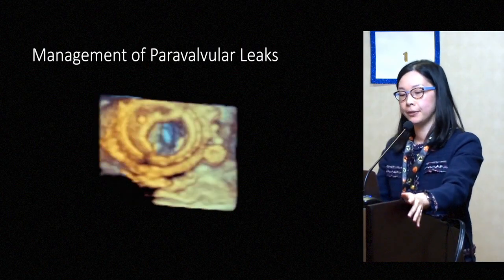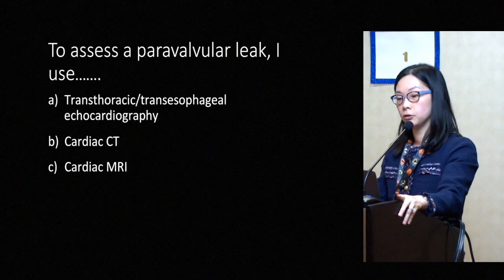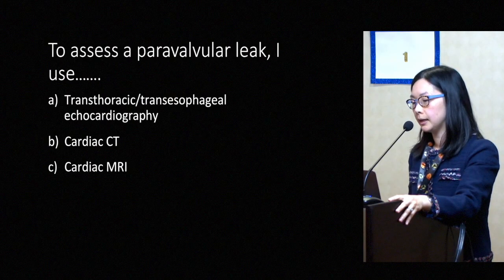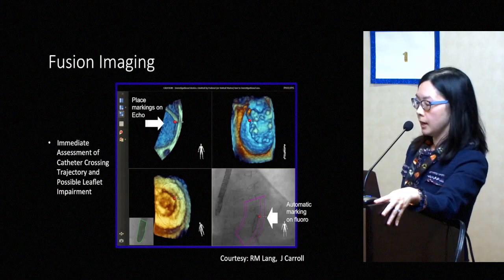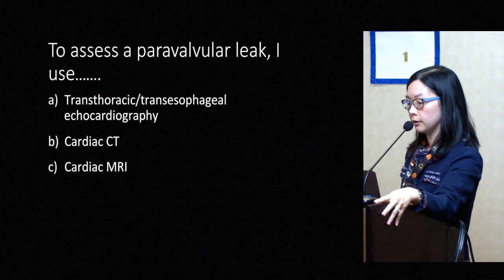But if you look at the statement that was released in 2017, just in the last month, about clinical trials for paravalvular leak, you'll see that echo is recommended, as it takes up almost half the table, and then fluoro has a little line here, and then cardiac CT and MRI are almost half the table. But really, if you read through the details, there isn't a lot of recommendation for that because there isn't a lot of data for that. And I'll show you some of the studies.